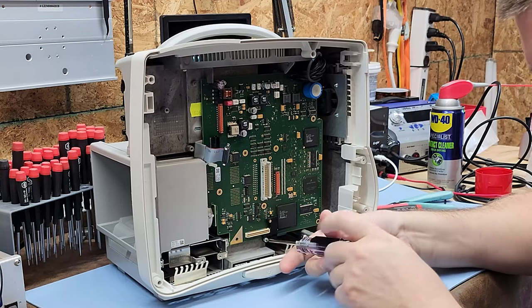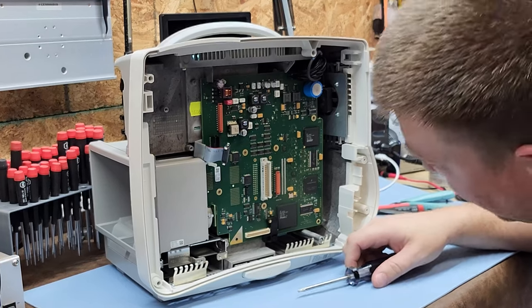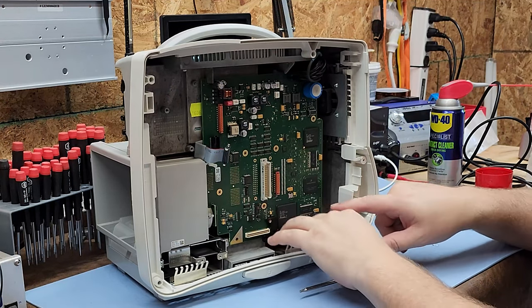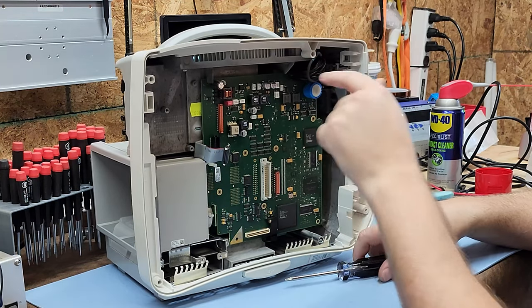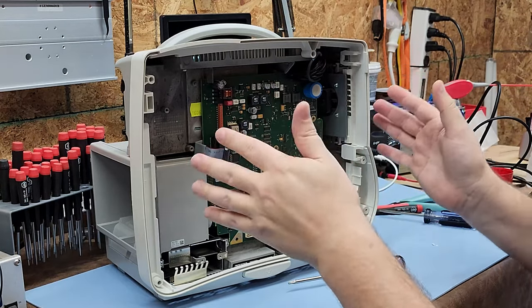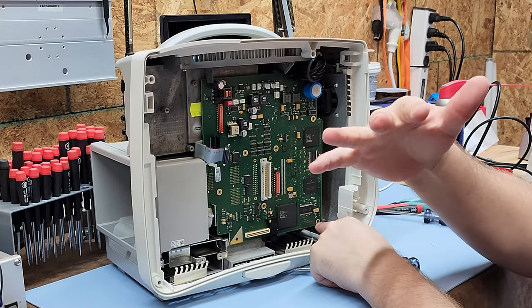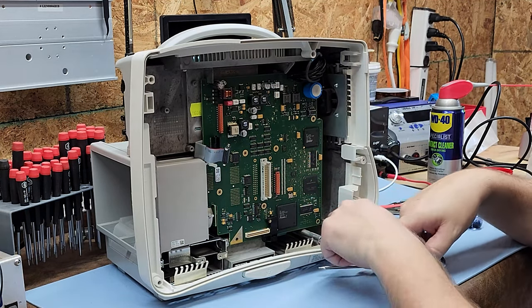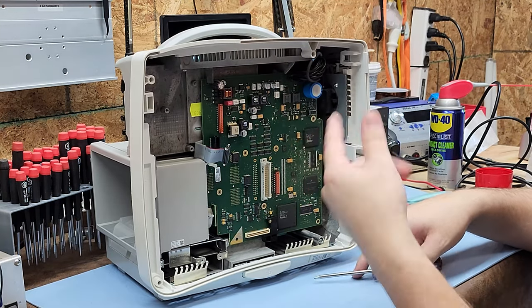A pro tip: I always leave the topmost fastener in until last. Once you start removing the others, the board wants to cant and puts extra stress on components. If you leave the top or center-most fastener in until the very last, there's almost no stress — the board will continue to sit where it was. That's why I always leave the highest or center-most fastener for last.